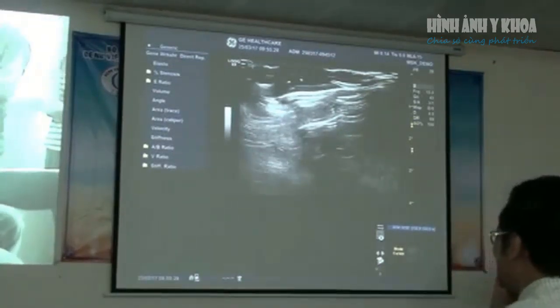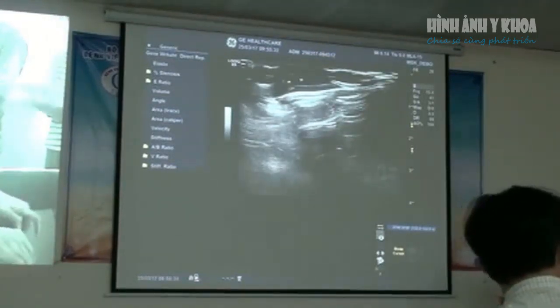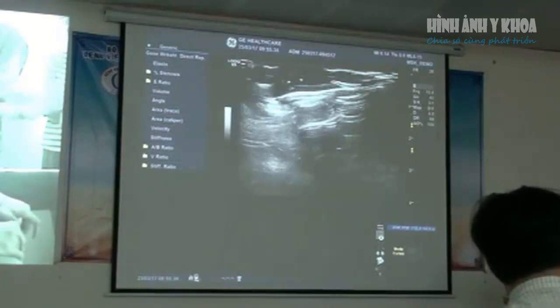So get them to sit up nice and tight. And I will just ask them to move their arms. So I'll ask them, can you do this?